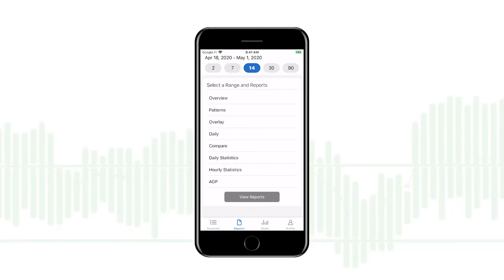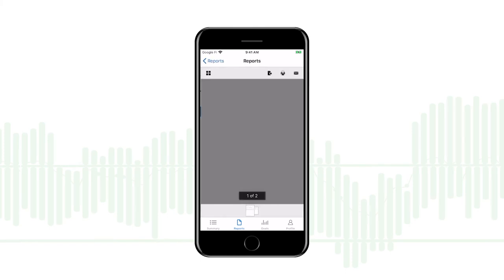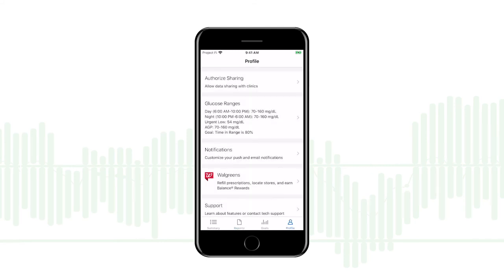I just select the date range I want and which type of report I want, and then I get a PDF that I can print, save, or email. From here I can also control notifications or emails.